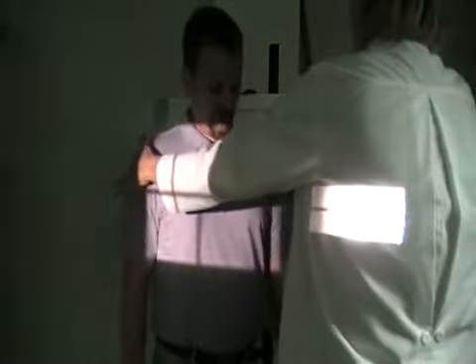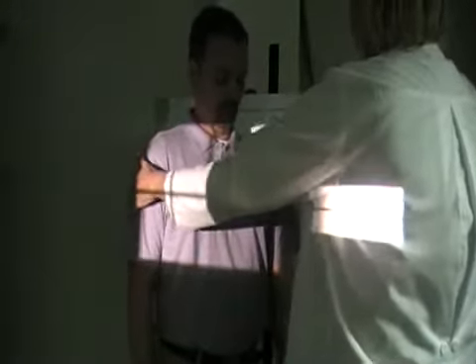Some doctors request a special projection of the chest by doing obliques. So I'm going to show you a left oblique of the lung. Again, this is a special request. It's not normally in the routine. So I'm going to turn David about 45 degrees.